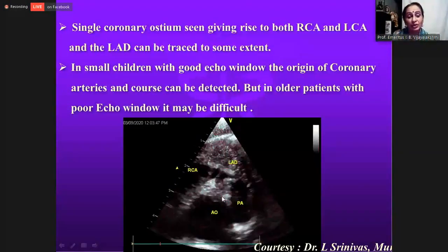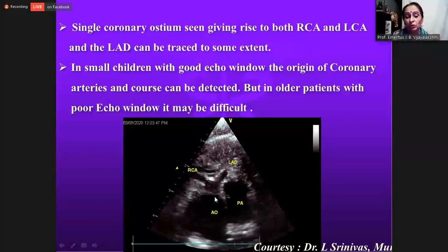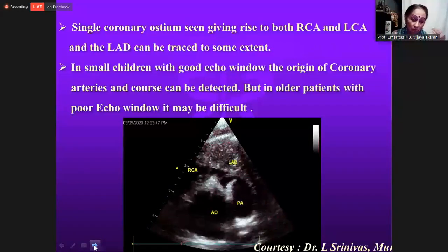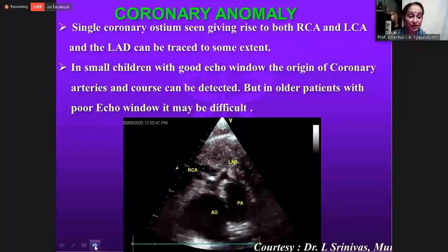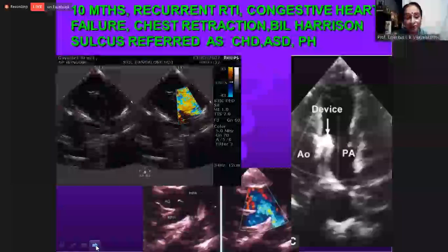And in a single coronary ostia like that you see here, in an infant and the newborn babies, the coronaries are very nicely seen, but when you go to the bigger children, it becomes difficult, and the coronary anomaly constitutes 10 to 12% of the pathologies, and if this anomaly is not told, the surgeon can cut while doing the infundibulectomy and get into trouble, and hence we go for the CT picture, the reconstructed image, and you get beautifully all the varieties of the anomalies that you see.